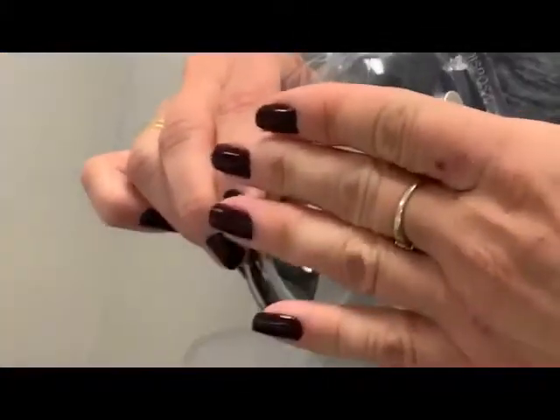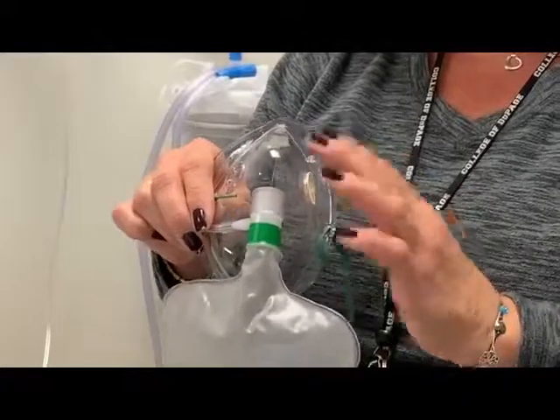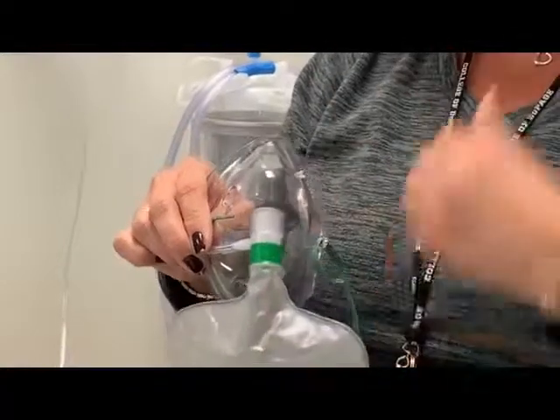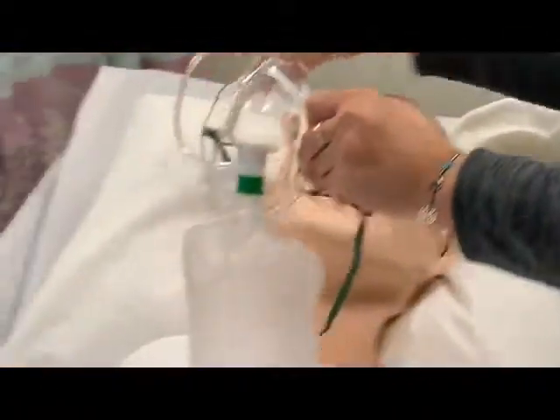The thought process behind this mask is that this is a reservoir bag, so what's happening is when the patient takes a breath in, they're pulling from this reservoir bag. You'll also notice that there's a valve on the outside. When the patient exhales, they can exhale out through it, but they can't entrain as much room air because of that valve on the outside. So your patient's going to be able to pull from more of 100% in that bag as opposed to more room air that's going to dilute what we're delivering to them. So you want to make sure that's inflated before you put it on your patient.